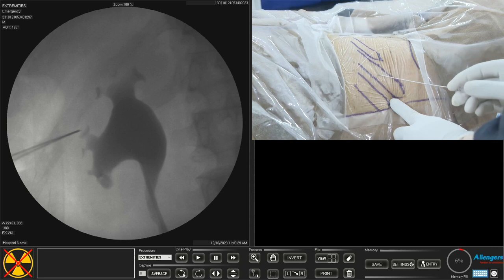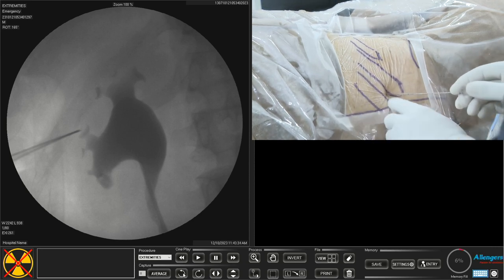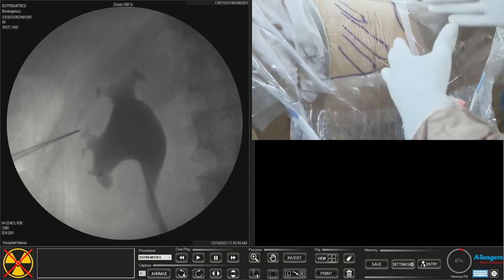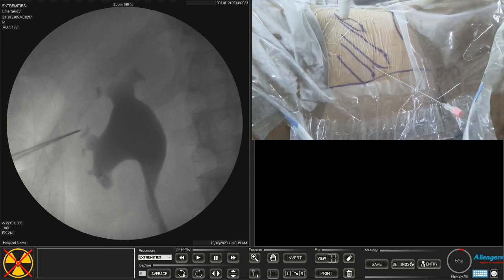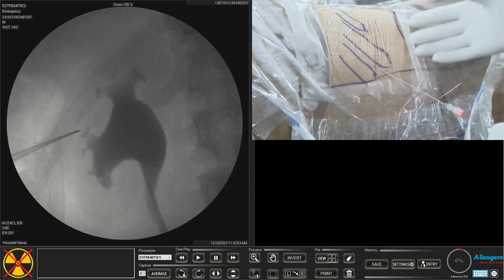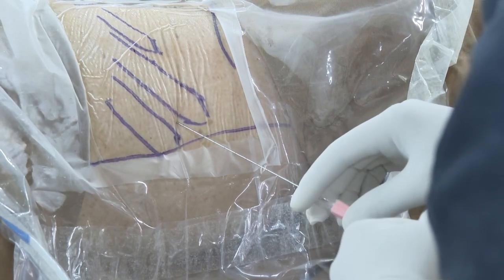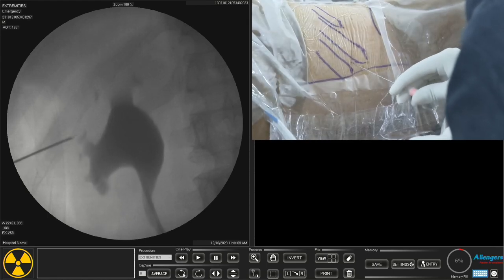Now the tip of the needle is at the planned calyx. I move the needle back — for a supra-11th rib puncture the entry is more lateral. I prefer to make a lesser angle with the coronal plane in mini PCNL because when the angle is more vertical, stone evacuation is more difficult. A more horizontal angle makes stone evacuation by irrigation very convenient.